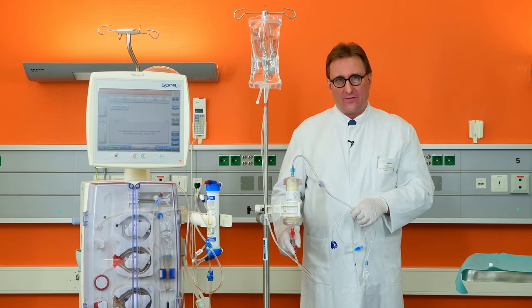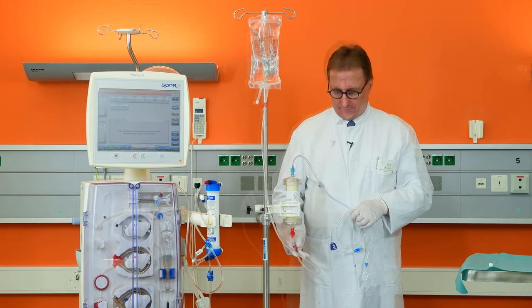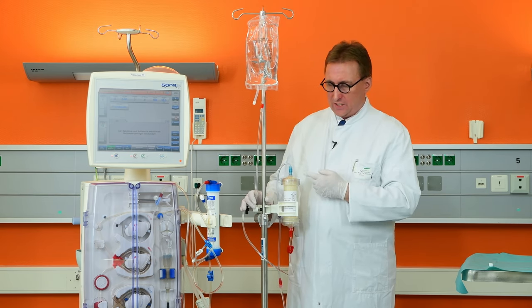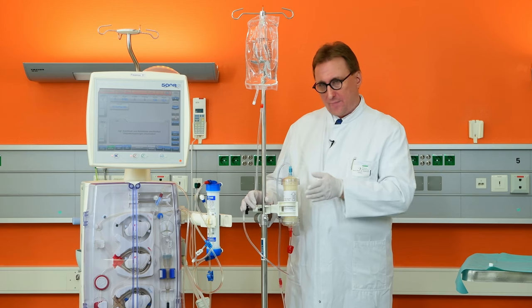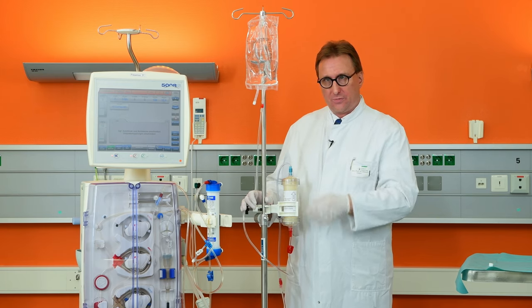Now after everything is connected, you can start the rinsing of the Seraph. During the priming procedure, please pay attention to air bubbles forming, especially in the outlet area of the filter. If this happens, gently tap on the side of the filter to allow air bubbles to be removed.